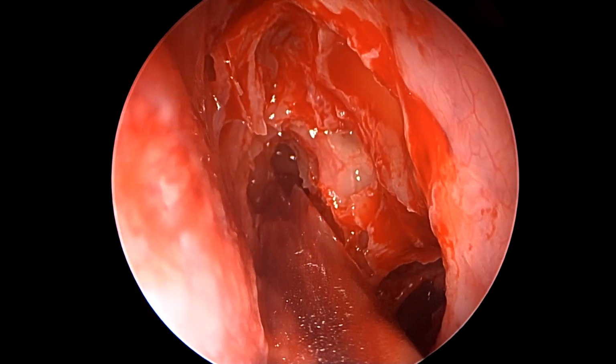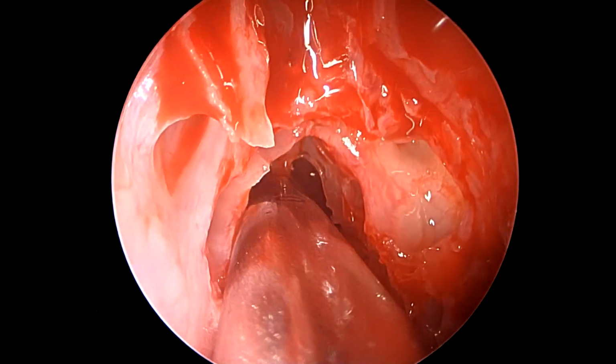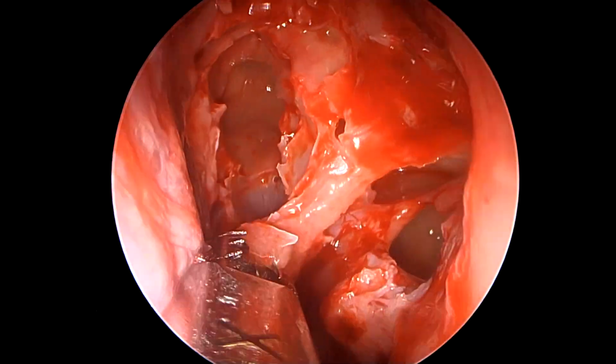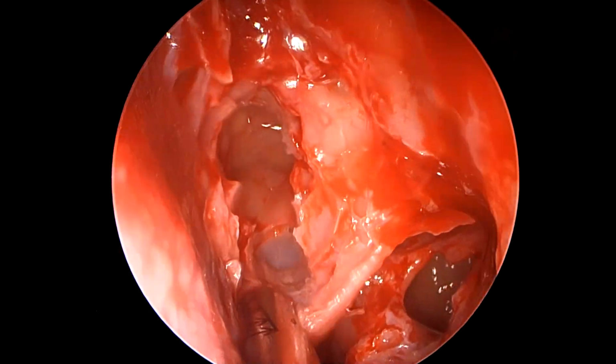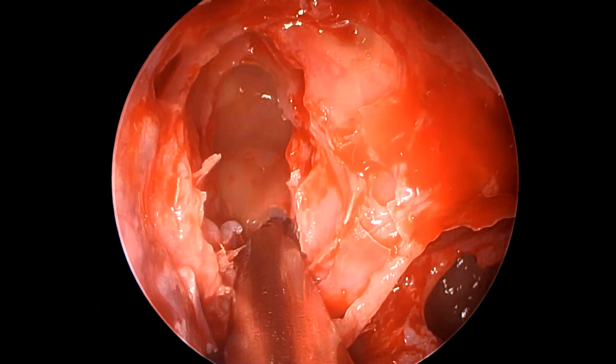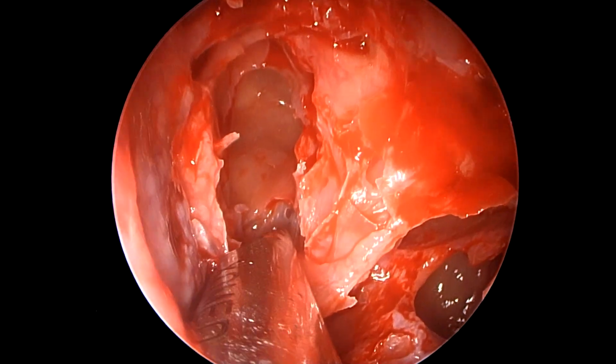It is prudent to identify the skull base posteriorly, where it is low, and then one can make your way anteriorly and superiorly, because one knows the lowest point of the skull base. We can see some polyps coming out of the posterior ethmoidectomy cavity, which we had already remarked on the CT scan.